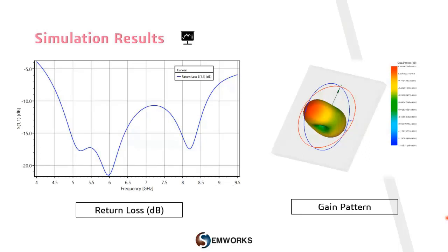The first curve shows the return loss of the antenna. It can be seen from the figure that the antenna provides a good performance in terms of signal bandwidth. The antenna realizes a return loss below minus 10 dB between 4.6 GHz and 8.7 GHz. And the antenna realizes a gain of 2 dB.